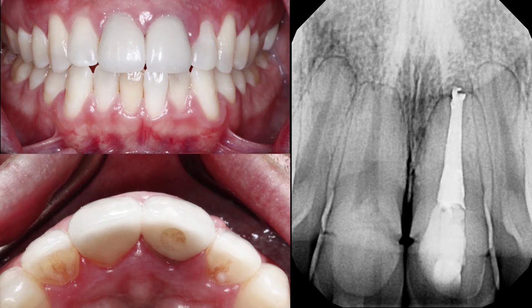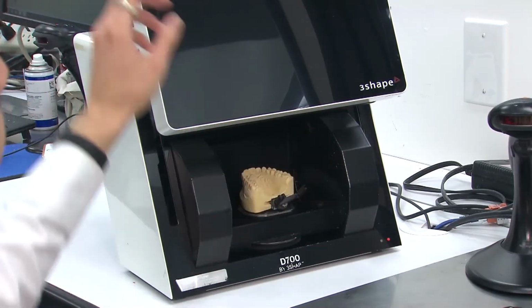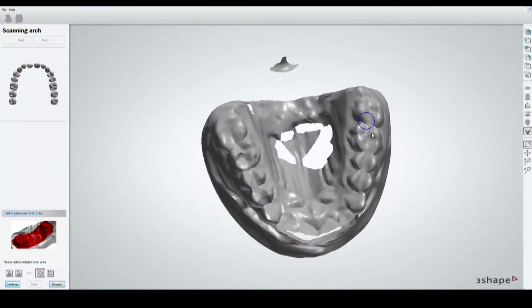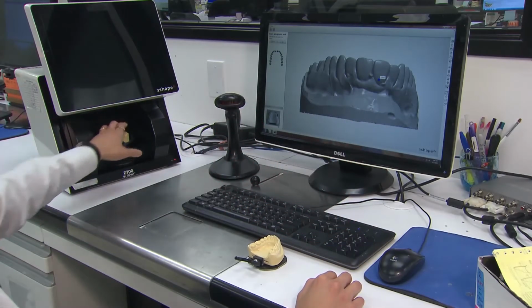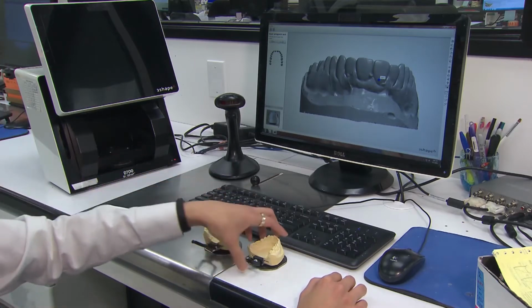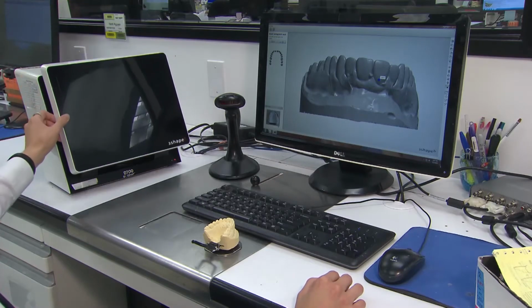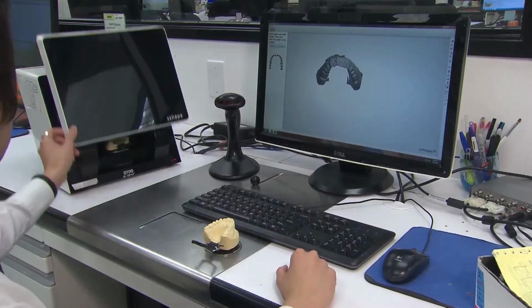to the laboratory. And the process for fabricating the BioTemps has obviously become more digital. So everything is converted into a digital file. Our technicians will fabricate the master cast, and once the master cast is in a solid format, we'll go ahead and utilize a desktop scanner to scan the cast and the opposing, and also a bite registration. So once all that information is digitized, then we can go ahead and digitally design the BioTemps, which we call BioTemps CAD or CAD-CAM assisted fabrication of BioTemps.